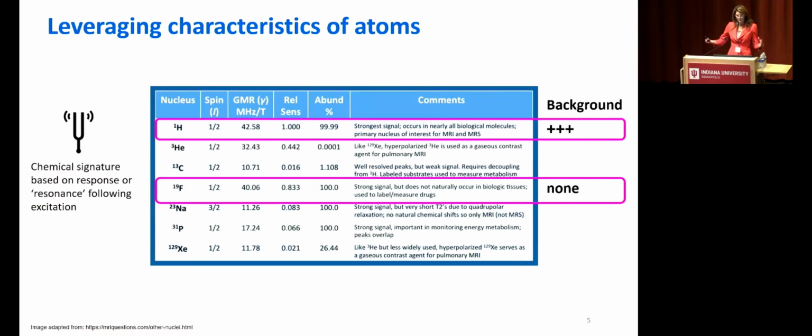And so you really have to have a much larger pool to be able to reach a level of detection. Not the case with 19F. The other thing is there's not any biological background, right? So we don't have fluorine in our bodies. The only reason it would be there is if we put it there, if you ingested it or otherwise. So those 2 main characteristics really set up 19F MRS as a promising method for drug detection for clinical pharmacology.